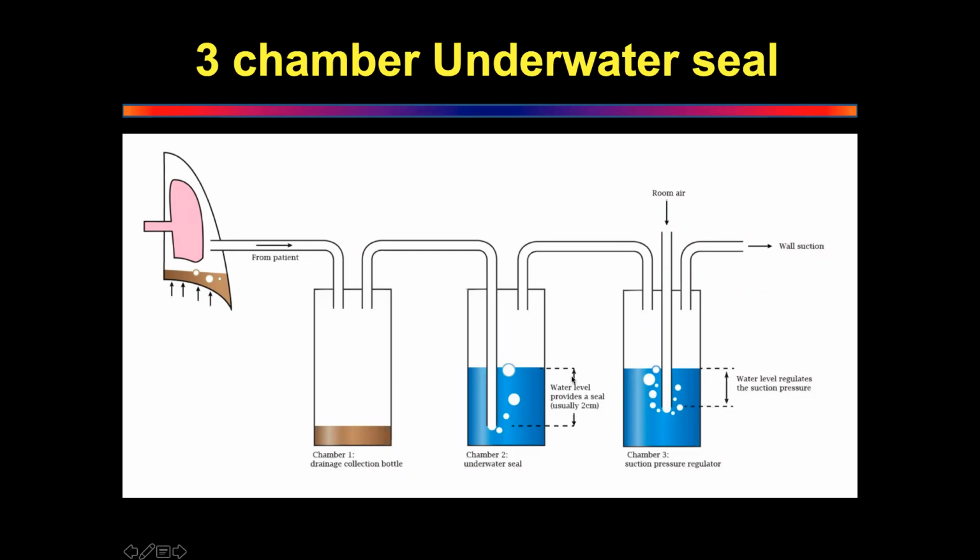Because see, this is sea level. This 2 centimeter is the sea level. This 2 centimeter is also sea level. But this gives you a vent for the suction. So you cannot oversuck the wounds. And none of this fluid will go back in the patient. There's a trap, a large trap. This air volume is quite large. It will not allow this fluid to go back. None of this fluid can go back.